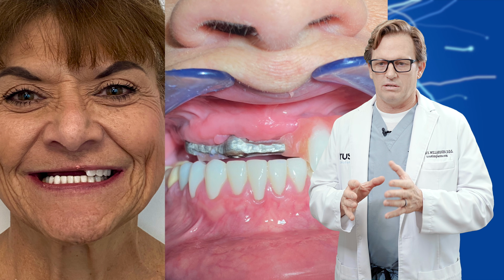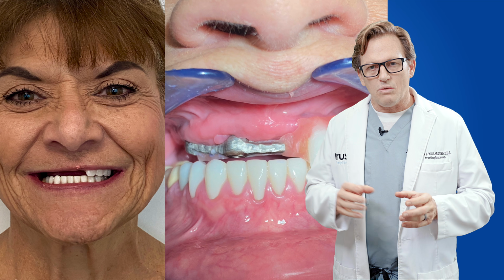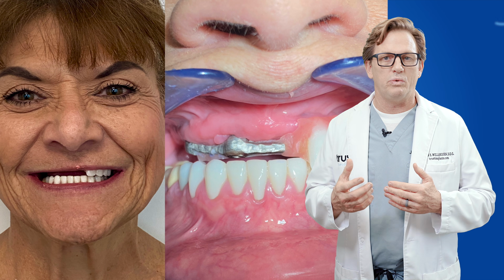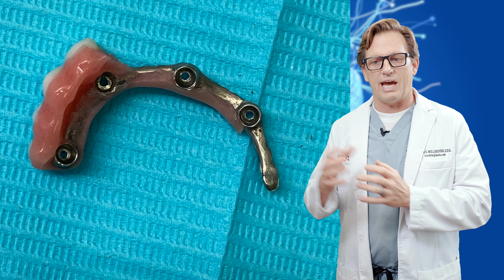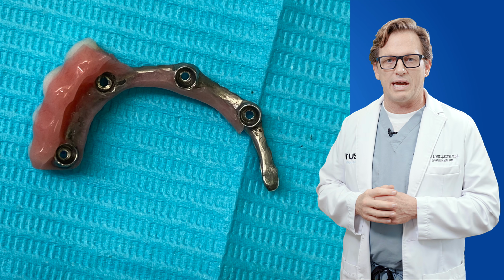So you can see here, this is a complete catastrophic failure. The case has to be redone. It can't be repaired or fixed. And so what we did was we placed additional implants so that we could give her that support in the back of the jaw and take the load off the front of the jaw. Here's the prosthesis out of the mouth. And you'll notice here there is a big cantilever off the back side.